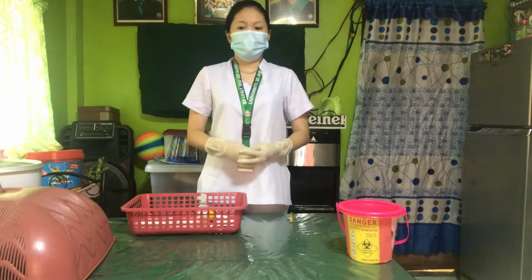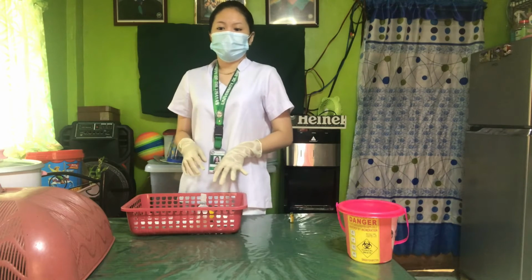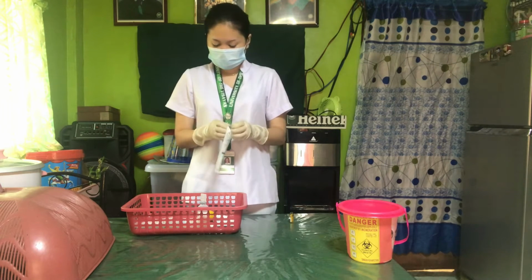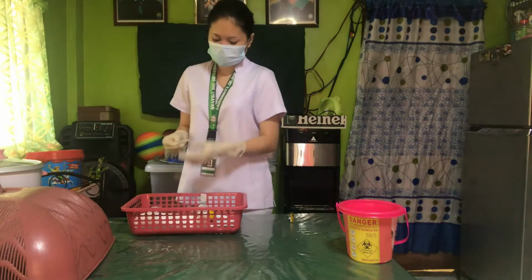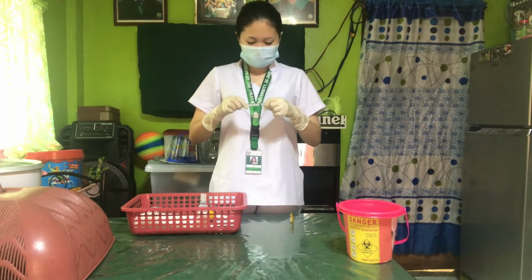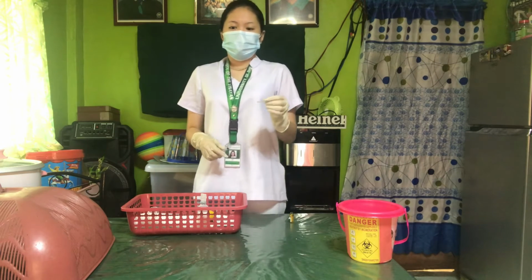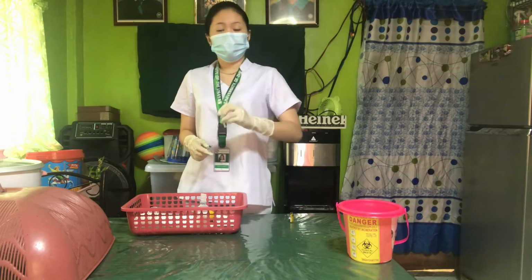Next is attach the filter needle to the syringe. Make sure it is attached tightly so as not to leak the medication. So we are going to keep this original needle because this will be used in administering the medication later to the patient.